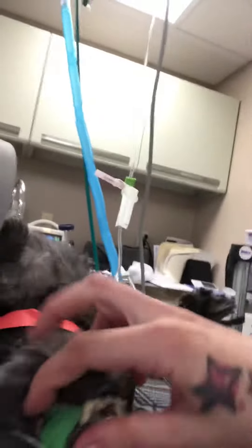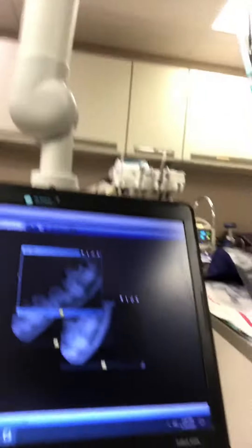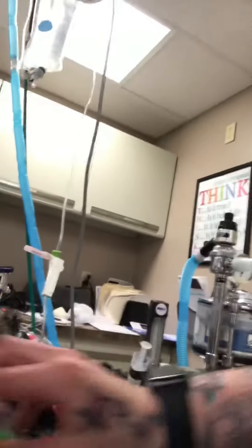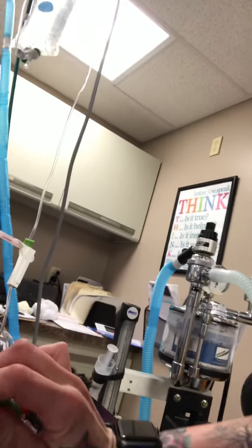We are doing a dental procedure right now and I'm getting them set to do our oral radiographs. We just had it positioned here which got our nine and our eight, and that gave us those photos which I'll submit along. Now I'm going to change it.